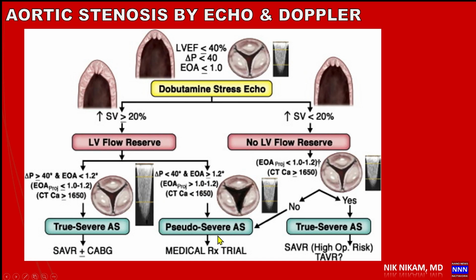On the other hand, if the increase in stroke volume is less than 20%, these patients do not have any left ventricular flow reserve.